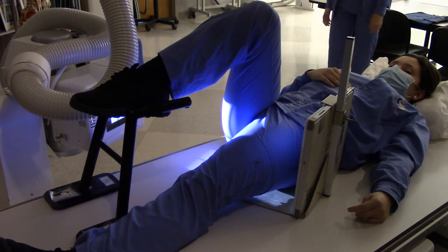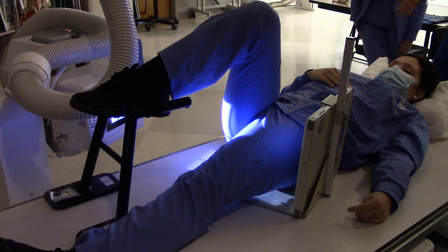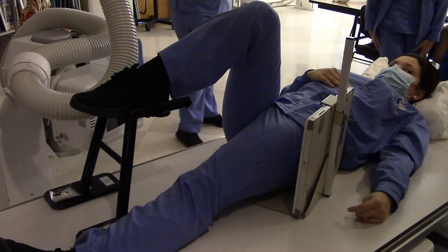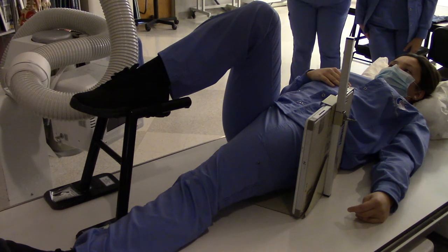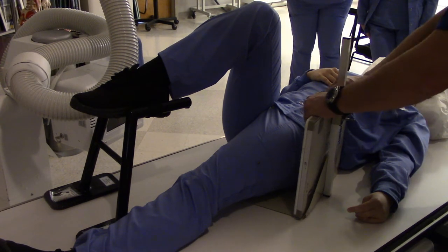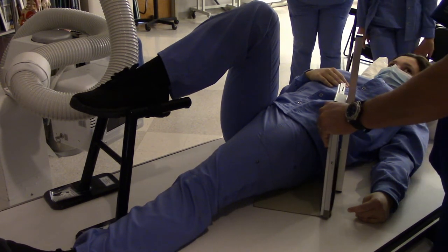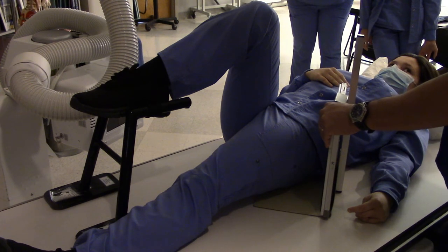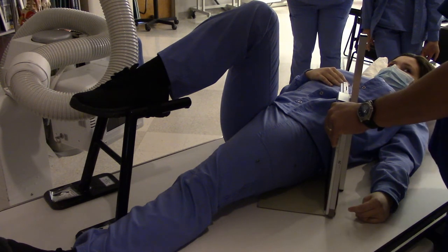The angle on your image receptor looks awfully shallow. Your patient is laying on the table, basically straight up and down. These floor tiles happen to be laid out at a 45-degree angle, so if your patient is straight on the table and your femoral neck is about at a 45-degree angle to the patient's mid-sagittal plane, you can angle accordingly. It looks like it's got way too much OID, but this will actually prevent some foreshortening to the femoral neck. Even though you will have some magnification, you'll get rid of the shape distortion.